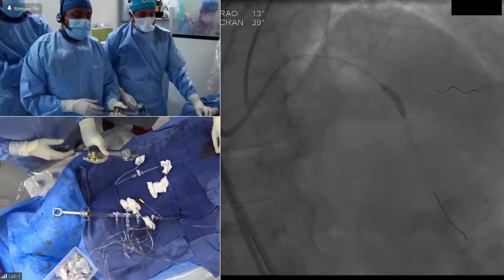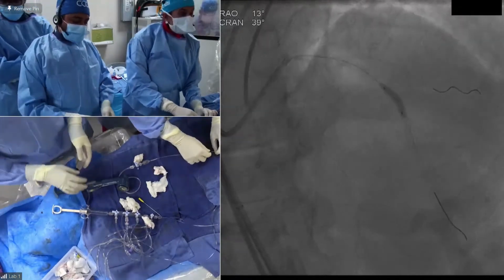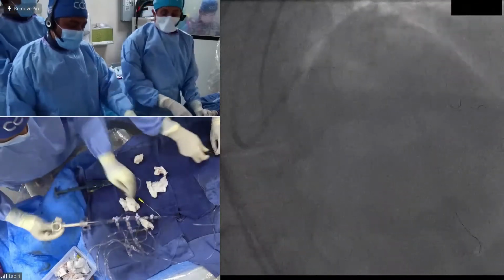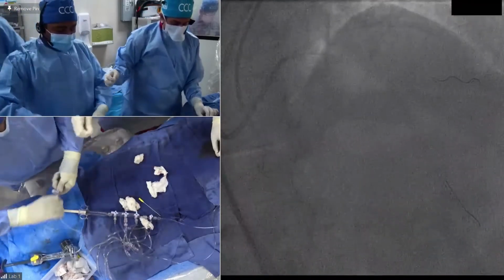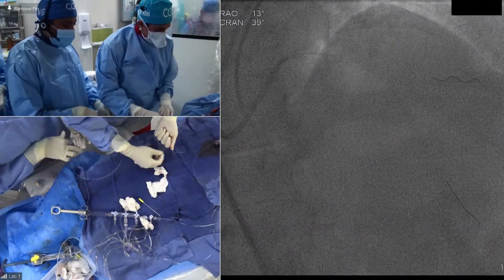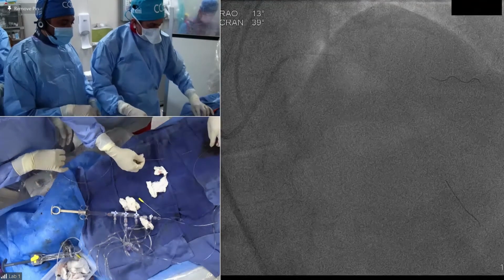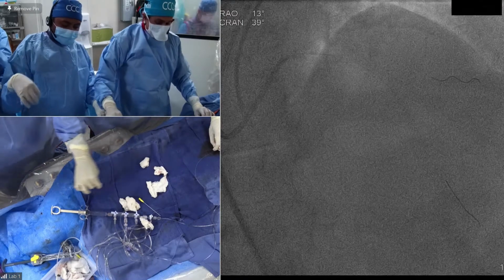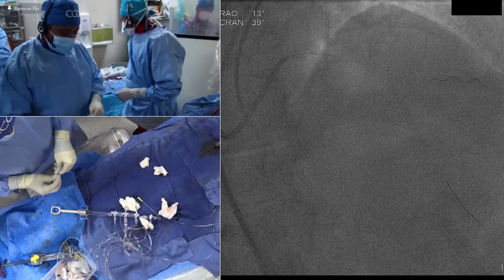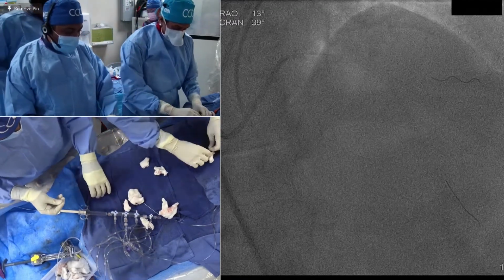Down. Now, important decision here. Are we going to do a 2-stent strategy or cut and stent across? Well, you can try with one stent and fine, but I think you'll still need to balloon the ostium of the diagonal. It looks tight. Yeah. And then make a decision based on whether you leave it provisional or take the 2-stent approach. Based on the criteria and what the app says, the side branch has a significant lesion and the vessel size is close to 2.5, which means we need a dedicated 2-stent strategy here. Yeah, it's probably more than 2.5.